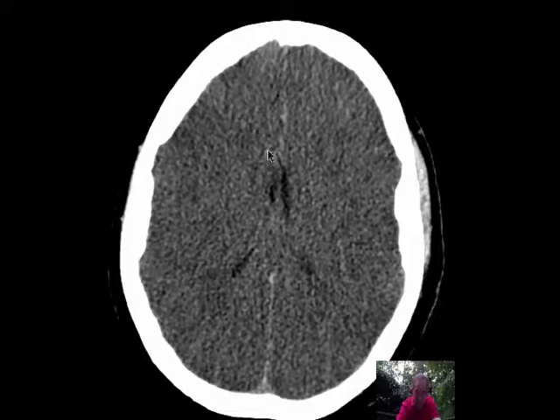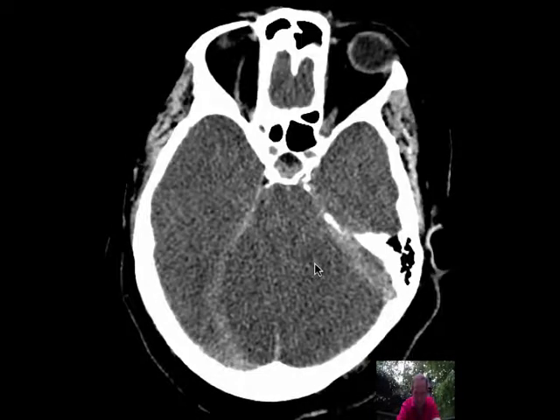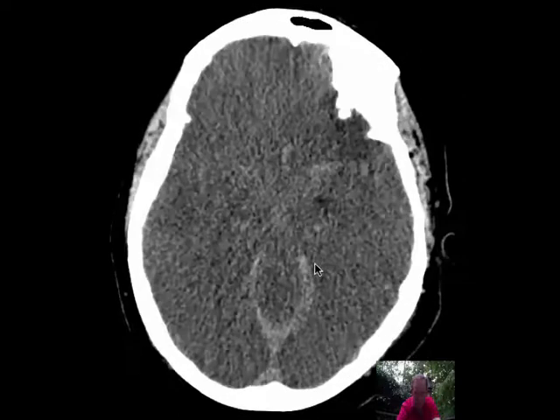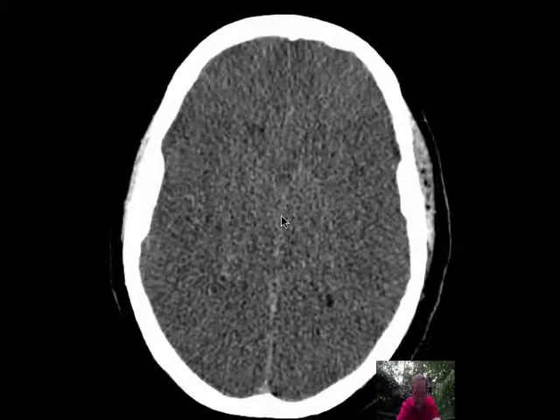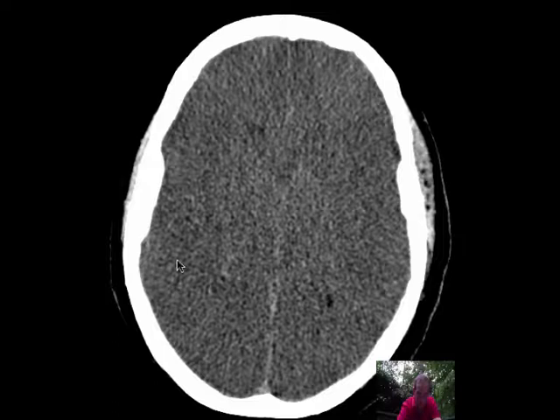That edema also produced mass effect compressing the ventricular system, including the lateral ventricles and the fourth ventricle. I don't really see anything of a third ventricle in between the two. Gray-white matter differentiation is nearly completely lost. You can see some remnant, I believe, of cortical margin.